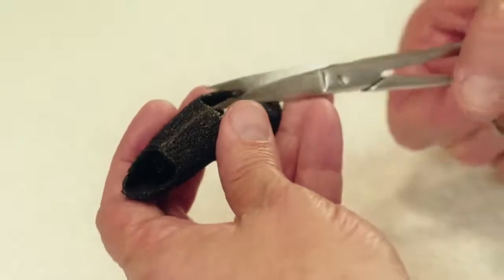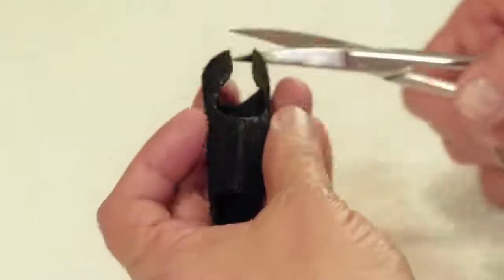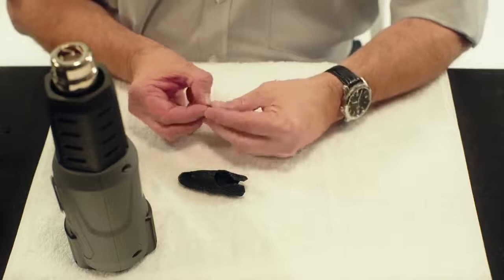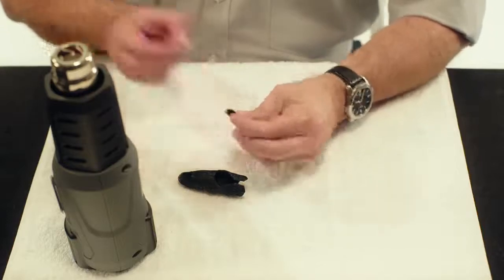Always be sure to round all the edges. Attach a small piece of Velcro adhesive-backed hook on the dorsal side.